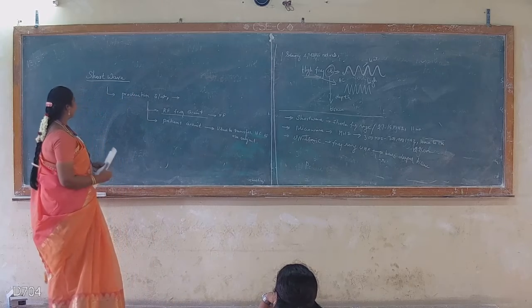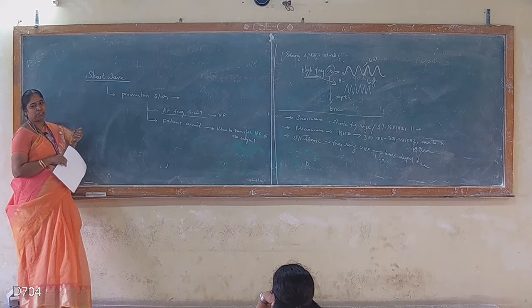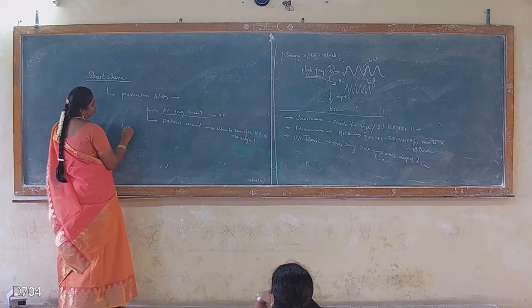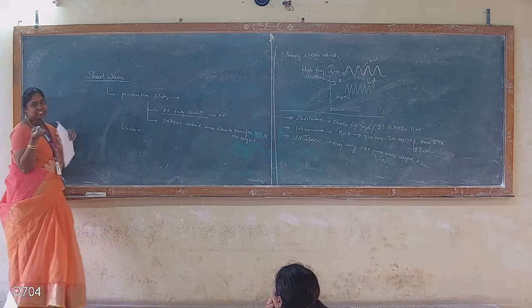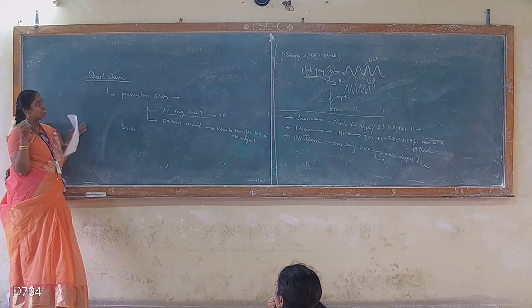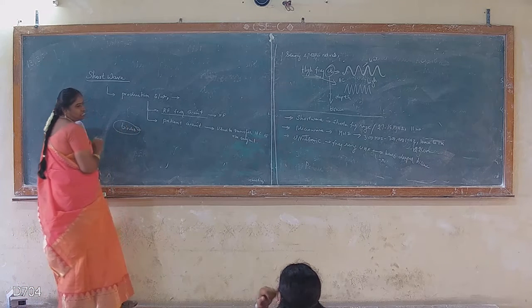Because this is the type of diathermy which was established when electronics came, initially these circuits were constructed with triodes only, not with diodes, then transistors, then large scale technologies, ICs. Because it was the first electronic advancement, these were constructed mainly with triodes only.